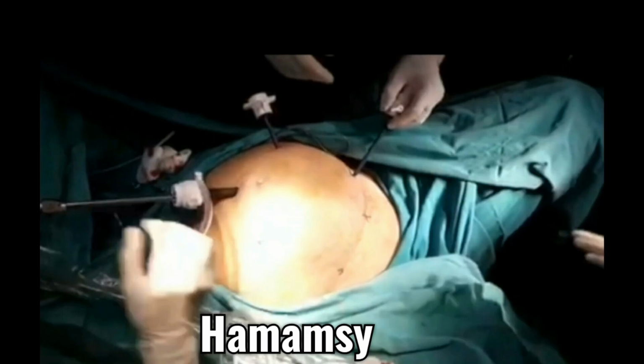بسم الله الرحمن الرحيم. Laparoscopic pelvic lymphadenectomy.